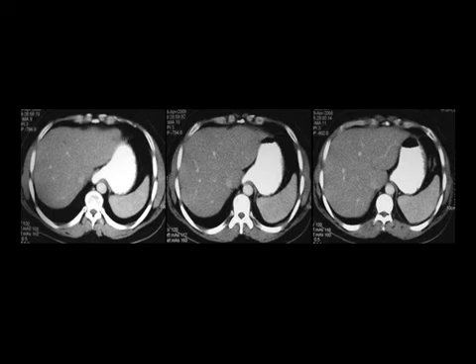This triphasic study cannot be performed by the spiral CT or by the standard CT. There should be a multi-detector CT of whatever channel: 4 channel, 8 channel, 16, 32, 64, any channel can perform the triphasic study of the liver.